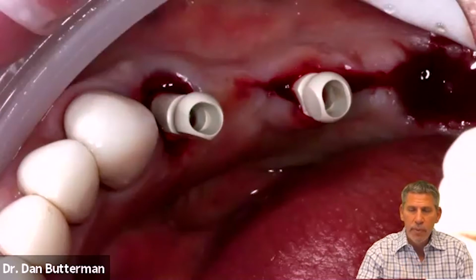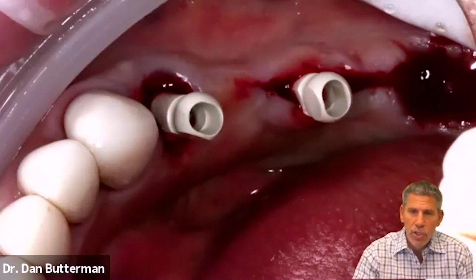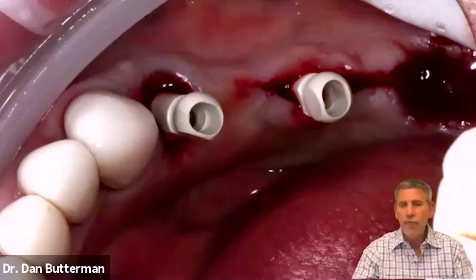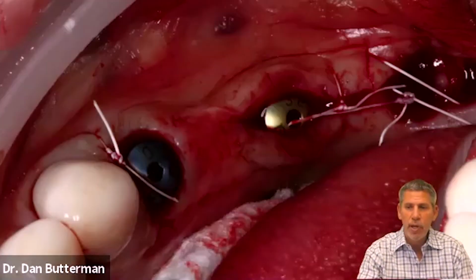And then once the implants are in, now I can extract the molar that we're not saving. So again, I want to have a custom healing abutment. I want the tissue to shape and be shaped rather than just a stock healing abutment. So at the time of surgery, I'm going to be doing imaging. How many of you would feel comfortable doing a physical impression on a surgical site like this? Probably most of us would not, but I'm totally fine to do an optical impression. I'm just taking a picture with my Prime Scan.